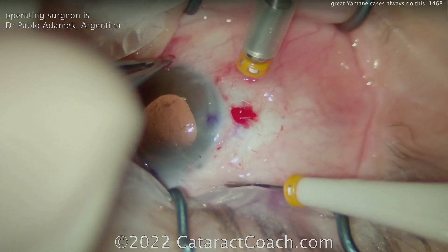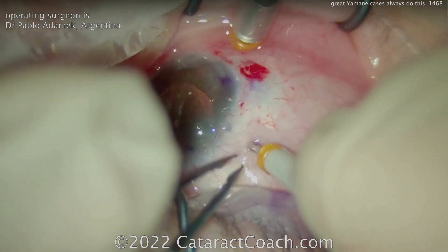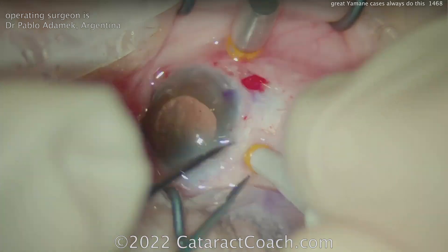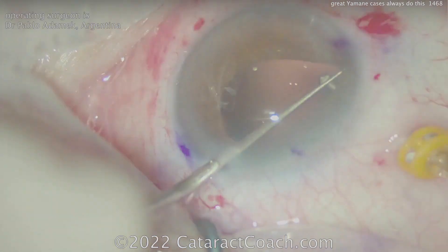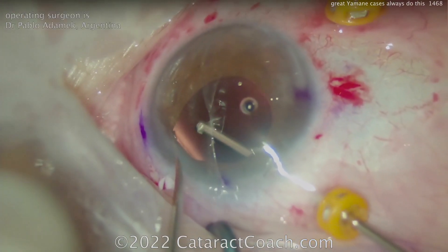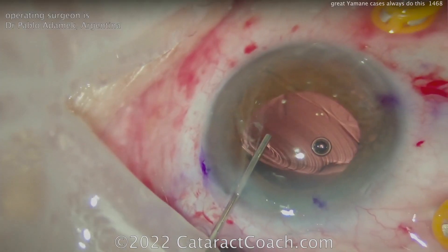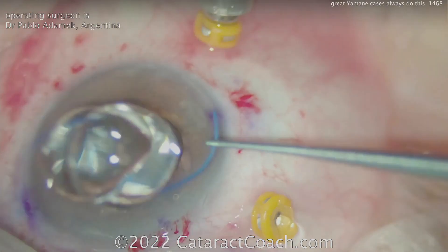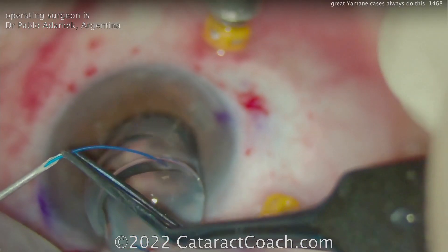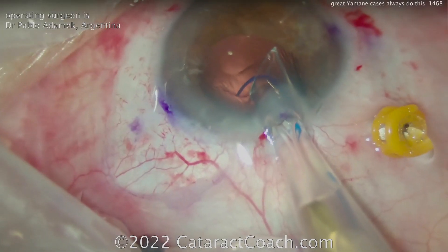Pars plana vitrectomy — that's right. I think your best option for patients where you have to do Yamane-type procedures or even other types is really to do a complete and thorough pars plana vitrectomy. That's because when you put that lens in the eye and manipulate it through the two scleral tunnels, the lens ends up going into the mid-vitreous. If you have a lot of vitreous in there, you're going to get vitreous entangled within that, and that's going to pose an issue. So he's checking the fit of the haptic, which looks good.